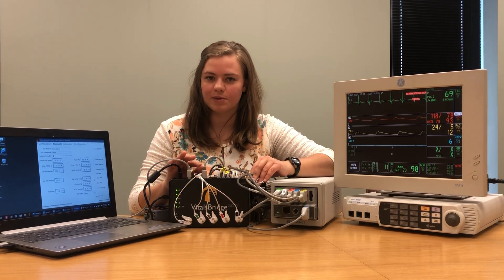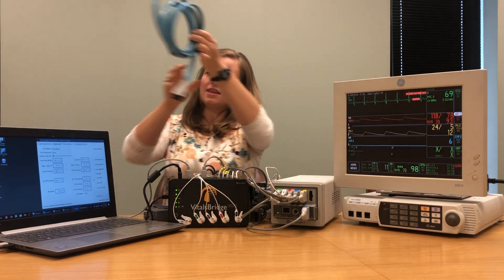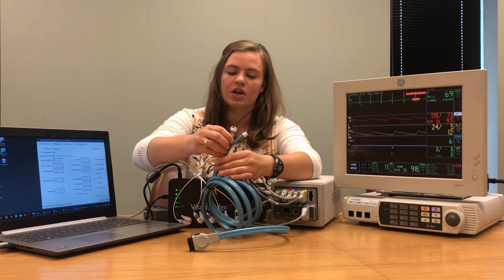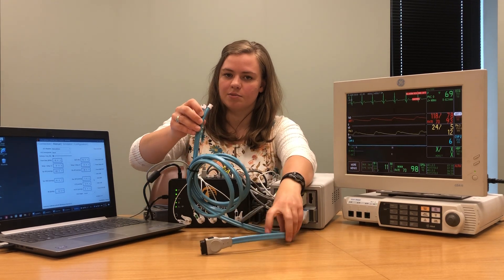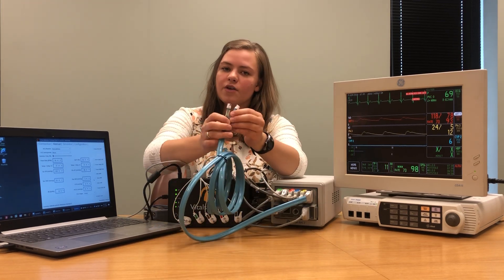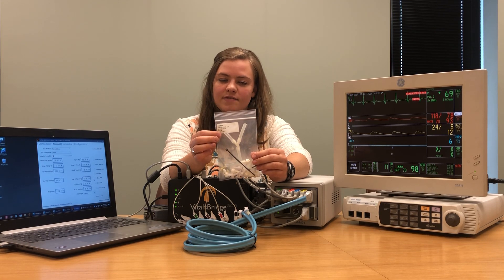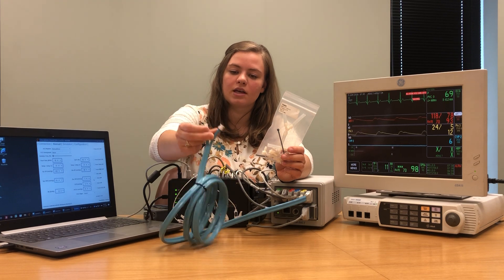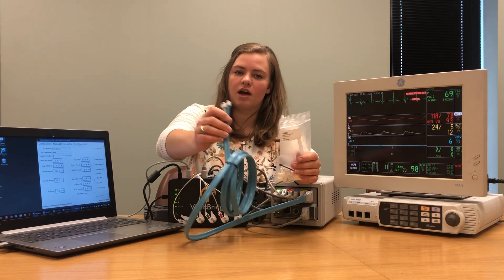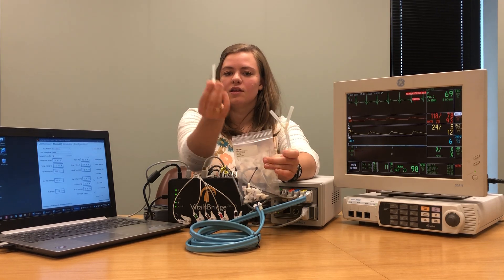The last thing we're going to do is connect our non-invasive blood pressure. The non-invasive blood pressure cable for your patient monitor has one end that plugs into your patient monitor and one end that plugs into a blood pressure cuff. Your cable may be a one-tube or two-tube non-invasive blood pressure cable. With your VitalsBridge you should have received a small bag that says NIBP fitting kit. Depending on if you have a one-tube or two-tube system, you'll use a different piece of tubing included with this kit. Since we're using a two-tube cable, I'm going to pull out the Y adapter. If you were using a one-tube, you would use the single tube adapter.